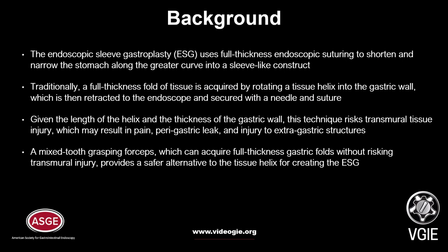The Endoscopic Sleeve Gastroplasty uses full-thickness endoscopic suturing to shorten and narrow the stomach along the greater curve into a sleeve-like construct. Traditionally, a full-thickness fold of tissue is acquired by rotating a tissue helix into the gastric wall, which is then retracted to the endoscope and secured with a needle and suture. Given the length of the helix and the thickness of the gastric wall, this technique risks transmural tissue injury, which may result in pain, perigastric leak, and injury to extragastric structures.